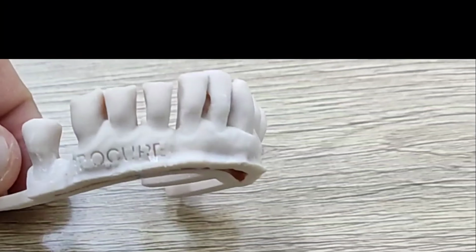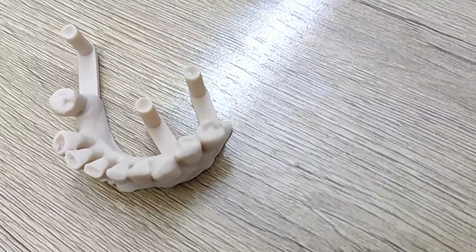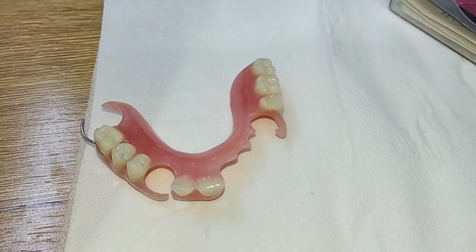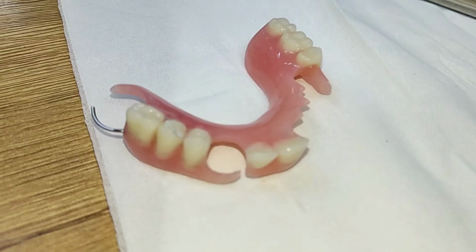Everything was done in 2 visits. The first used the intraoral scanner and the second was insertion of the partial denture. The denture fit well and the patient was satisfied with the result.